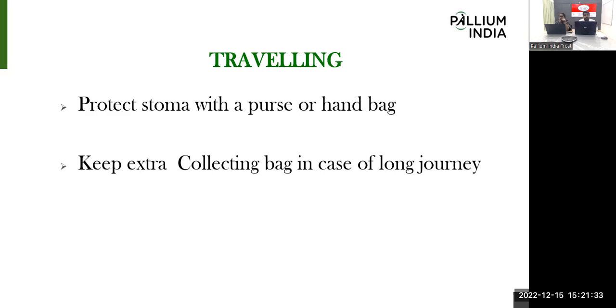Then an extra collection bag also, if they are on a long journey, they need to carry extra bags. Because I told you, when half or at most three-fourths of the bag is filled with fecal matter, in between they need to evacuate and empty it.